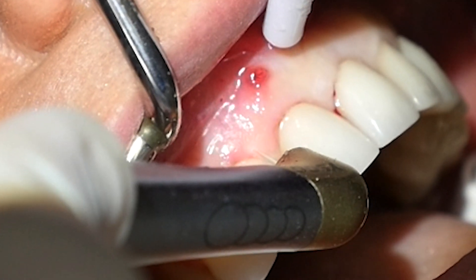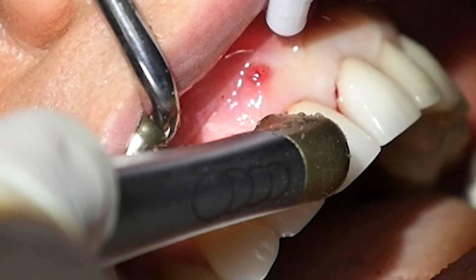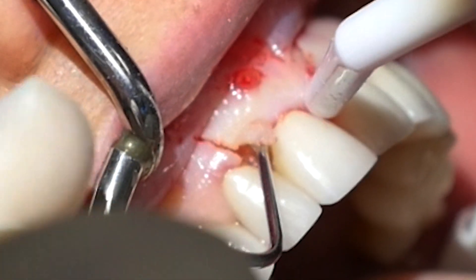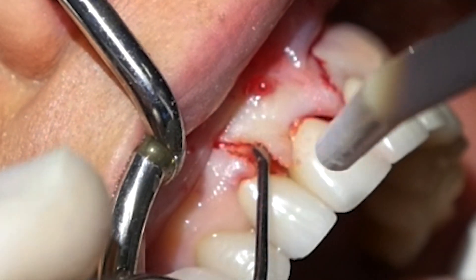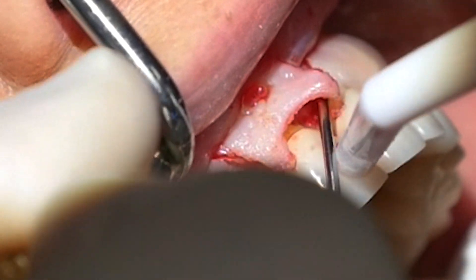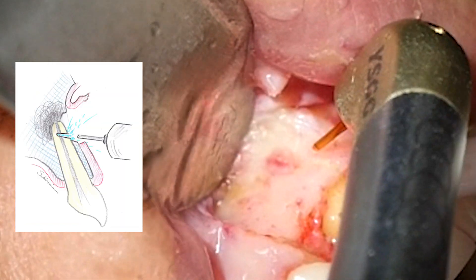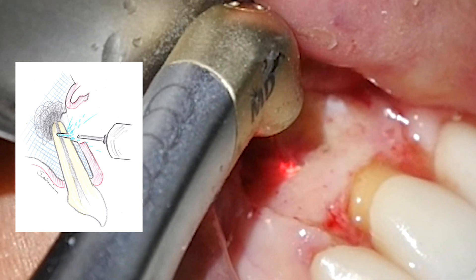The incision is carried out with the laser. Access into the lesion and the tip of the root is carried out with the Water Lase at higher power.